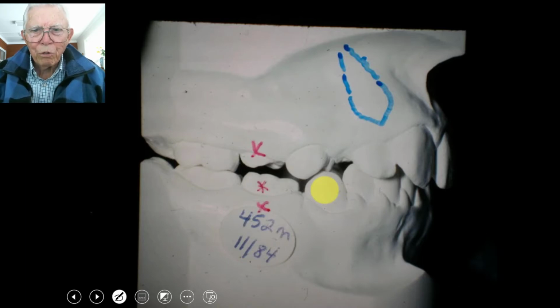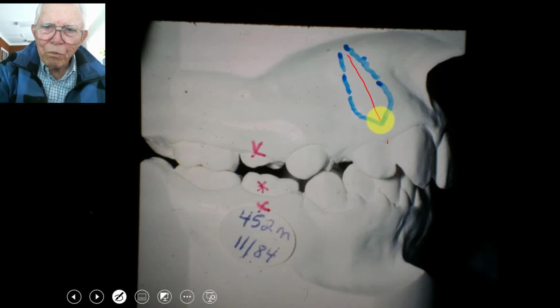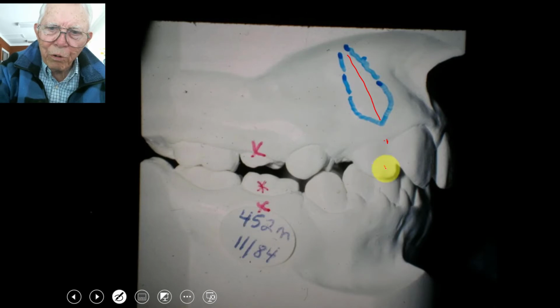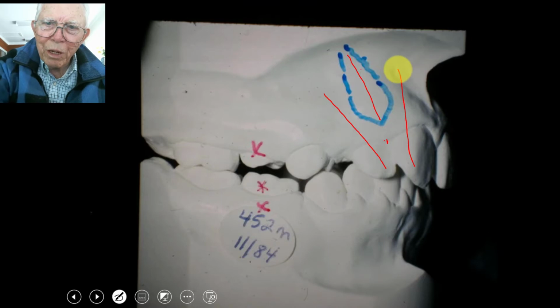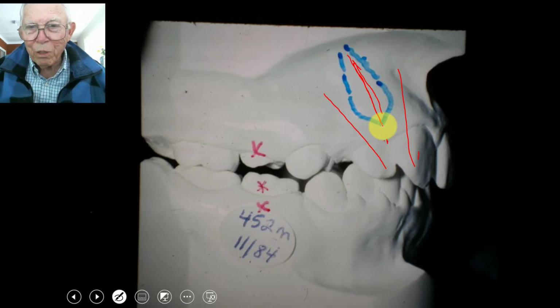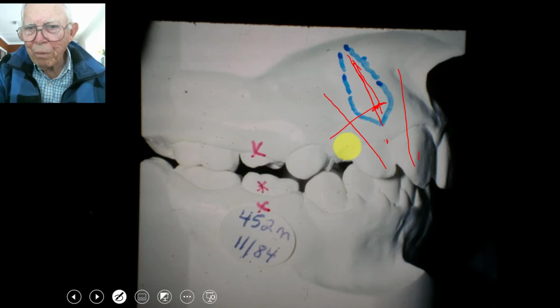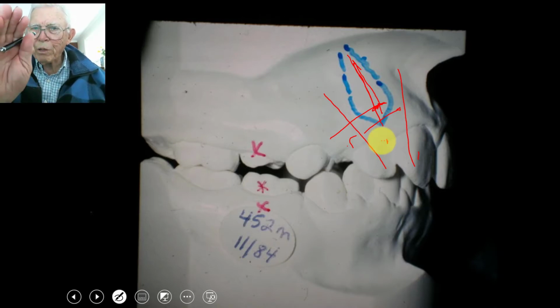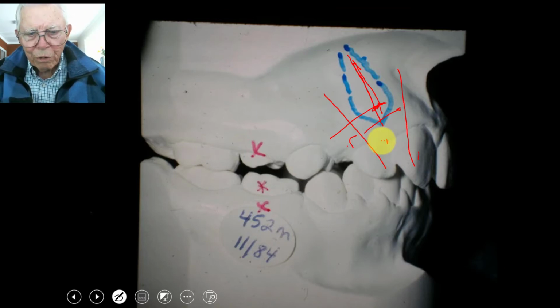Now we've got an unusual thing where the cuspid tooth is trying to come between the lateral and the central. You notice the lateral's kind of headed off like that, and the cuspid is going up like this, and the cuspid is coming down between the two teeth. So that's going to be good. We're going to hook onto it and pull it over as we kind of push the lateral back in that direction. But don't try to bring the lateral up, just let it stay in the roof of the mouth like it is as you bring it across.